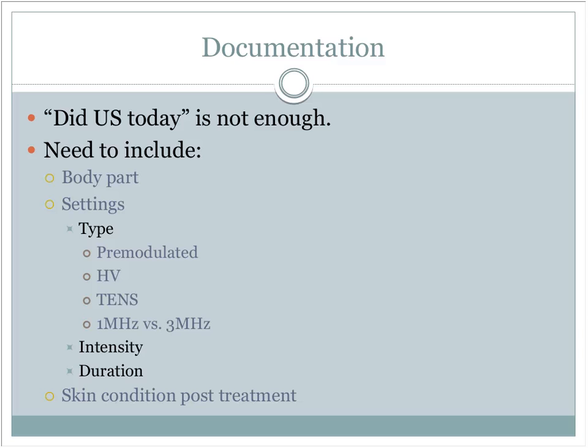The intensity, and I know I said don't get hung up on the intensity having to be the same all the time or slightly increasing, but put it down so that people know, okay, they're running this typically around 12 to 15, and then the next person comes in and they've got to crank it up to 30, something's not right. Instead of saying, well, I don't know, maybe that's what they had it on last time, so I'll just leave it up that high. So document the intensity so somebody has a ballpark, but don't get hung up on having to achieve that the next visit. And the duration, how long did you provide that?